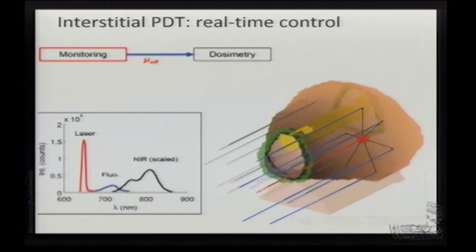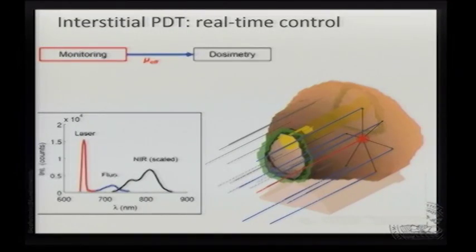What is the fluence rate? We need light in order to do PDT. We need photosensitizer in order to do PDT, so we can assess the concentration, as just mentioned. And we can also get how much oxygen you have, or how much oxygen is bound to hemoglobin. So you can measure the oxyhemoglobin content by doing spectroscopy here. All optical measurements, quite simple, using diffuse reflectance or diffuse transmittance, whatever you would call it, between fibers.